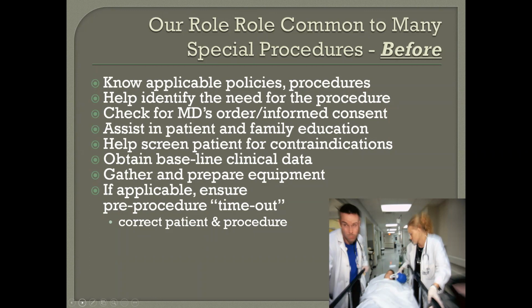More importantly, it helps ensure consistency when you're assisting with a bronch or assisting with or doing an intubation. Number one, it's one of the definitions of a highly reliable organization, where they do the same procedure from patient to patient very consistently. The second thing is it's good for the patient. Not just that it's consistent; it's safer for them. It's evidence-based. If I do it, or if Terry does it, or someone else does it, it's good because we know it's being done with a very small amount of variability and a good amount of reliability and repeatability.